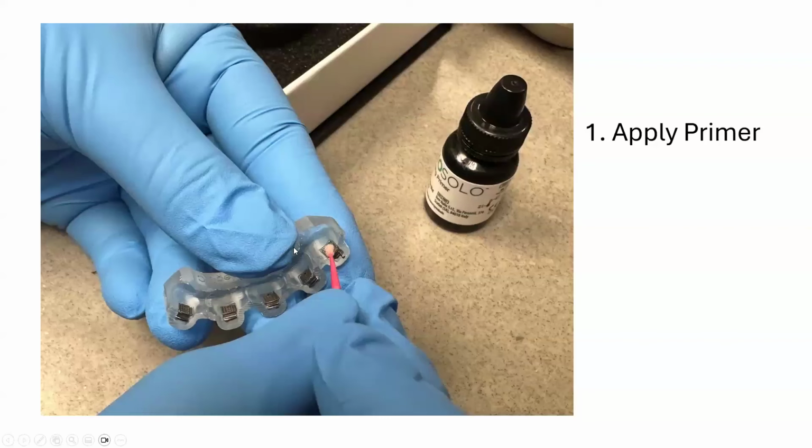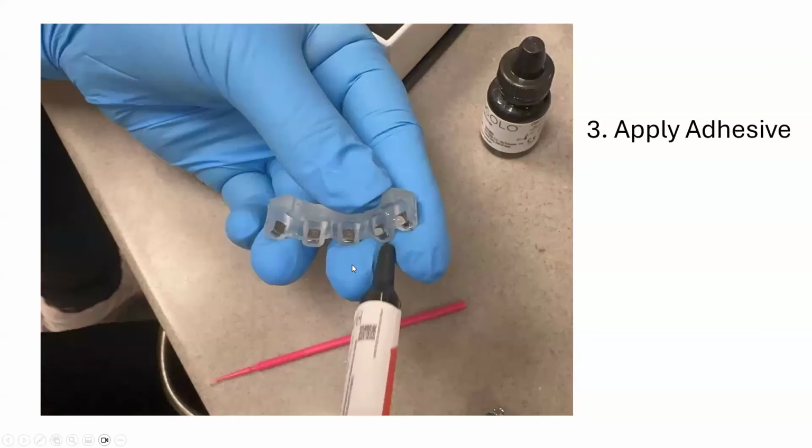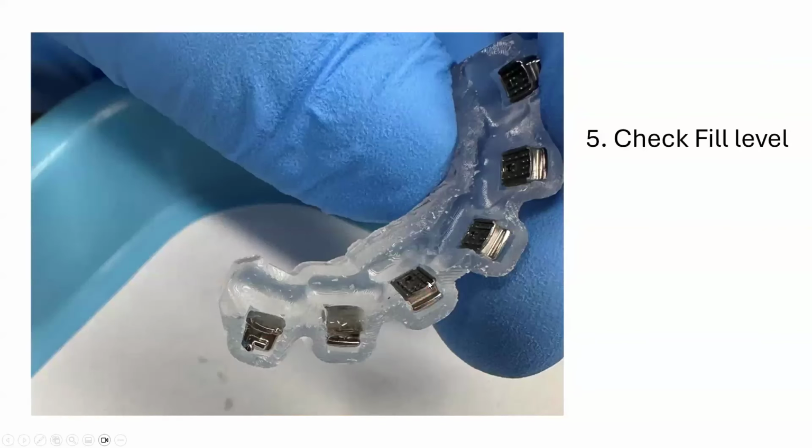Okay, so this just shows a little bit about how our team sets these up. The first thing they do is put some primer into the pad of the bracket. They lightly air dry the primer. Next, and we're using Go-To right now, they butter in some Go-To. And the way they know how to fill them, they butter it in and use a micro brush with a little bit on there.